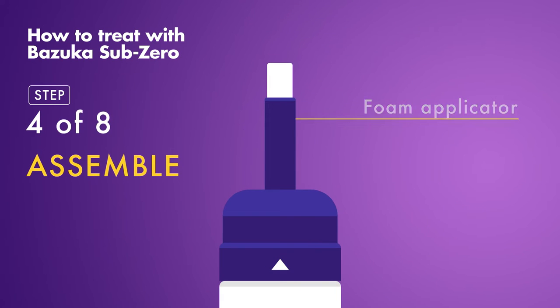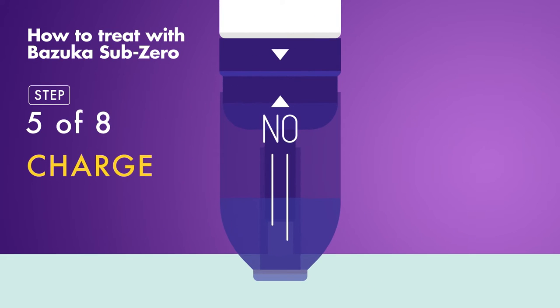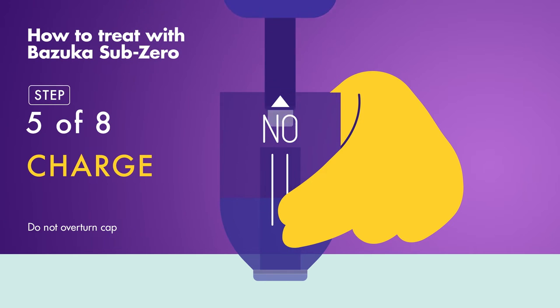Next, assemble the applicator so it's ready for freezing. To charge, steady the device on a flat surface then press down firmly on the safety cap for one second. Hold the activator cap down on the surface with one hand and remove the device with the other, taking care not to overturn the cap.